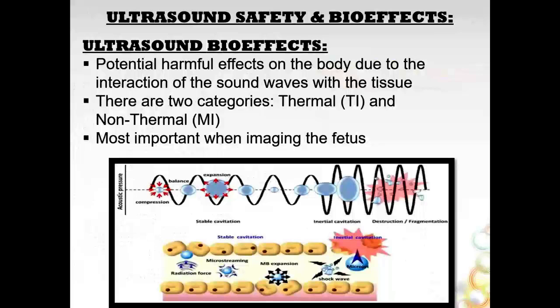All right, so ultrasound safety and bioeffects. Ultrasound bioeffects. A bioeffect is the potential harmful effect on the body due to the interaction of the sound waves with the tissues in the body. There's two categories, thermal, which is TI, and non-thermal, which is MI. Most of the time we care about this when imaging the fetus or the baby, but it's important to keep in the back of your mind.